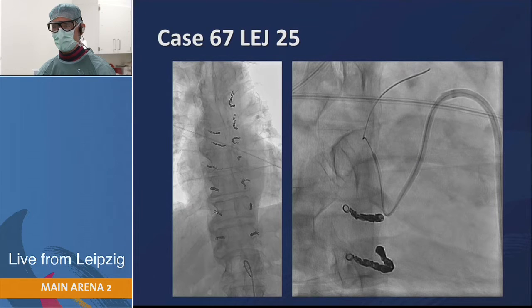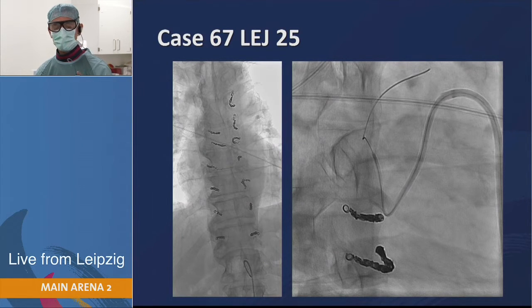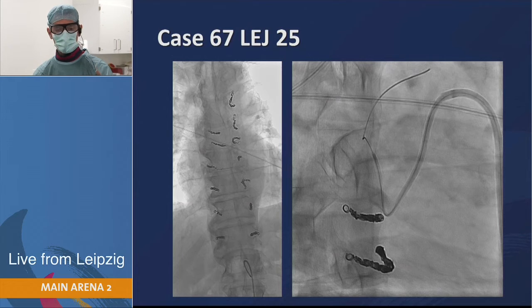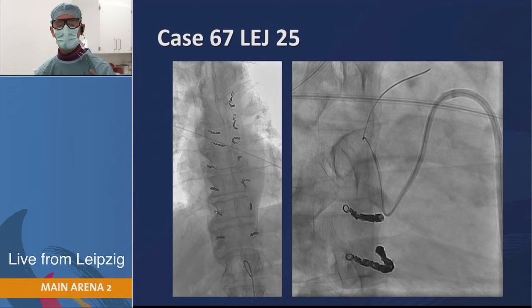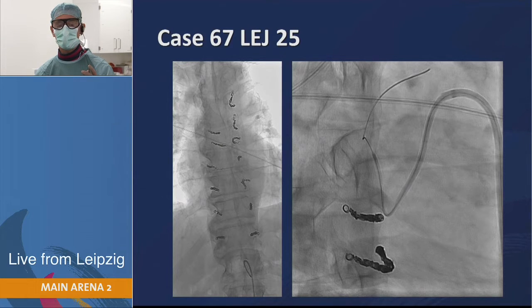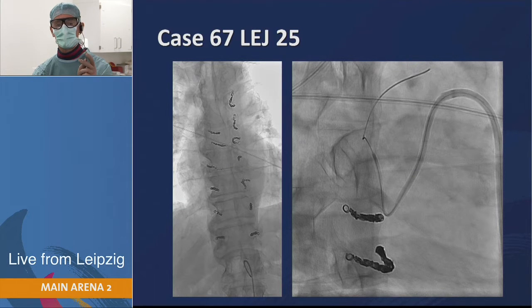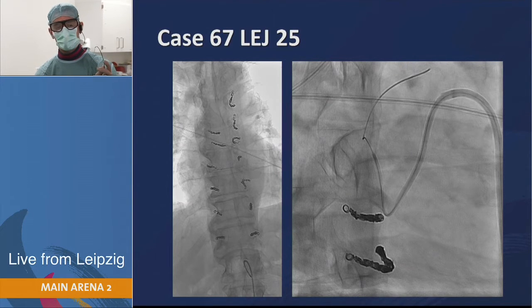This is a three-axial method we are using. We use a 6-French IMA guiding catheter, which we usually use for renal artery stenting, and we take a 5-French SOS or Sidewinder 1 catheter inside. The nice thing is that with this outer catheter you can change the angle of the Sidewinder 1 catheter. If the aorta is a little bigger, you can easily reach the tip of the catheter to the aortic wall. Then a small coiling catheter goes in for coil deployment.